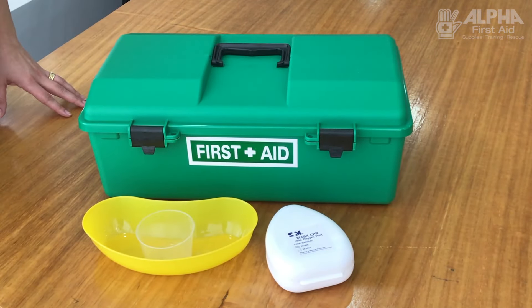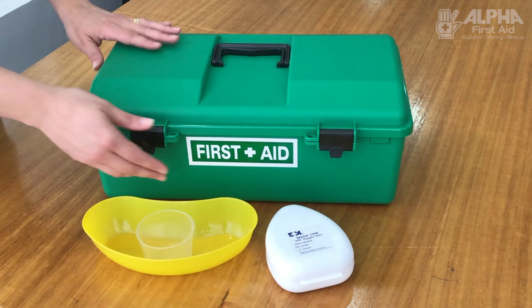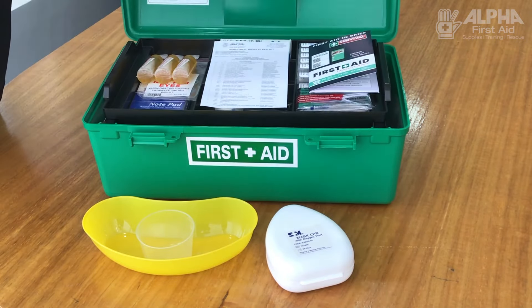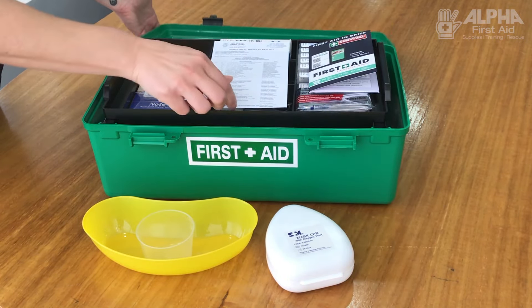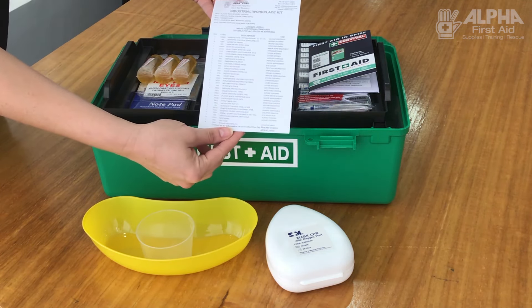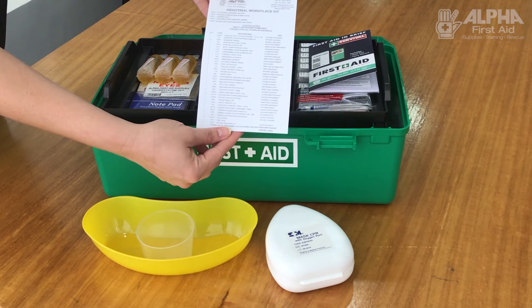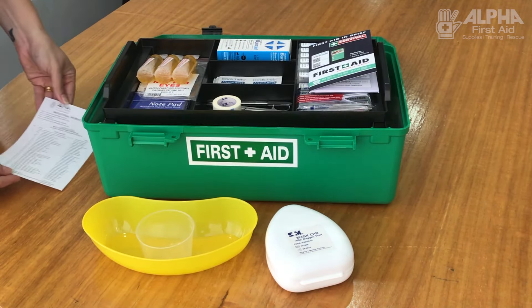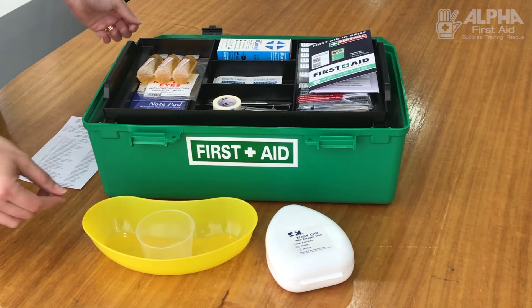Congratulations, you have now been allocated to check your first aid kit. Let's have a look at what would normally be in a first aid box. The most important thing to look for in the first instance is your content list, and that's the best way to go through and check exactly what's in the kit. But we'll go through some of the items so that you can at least identify what you have in a kit.